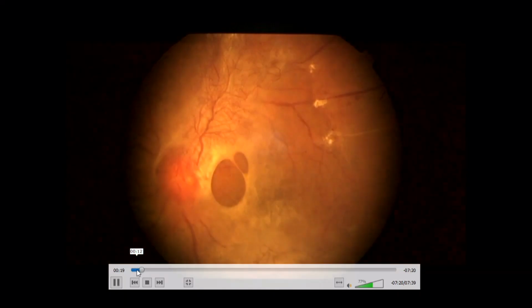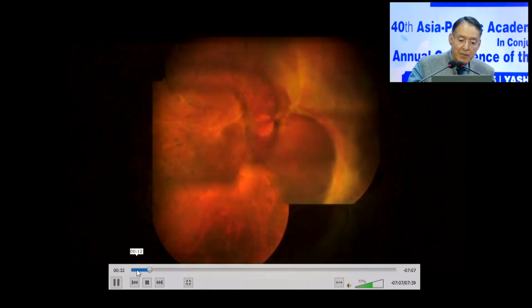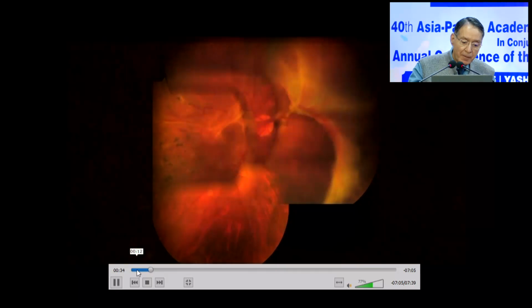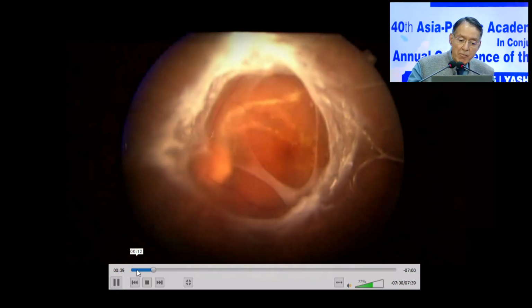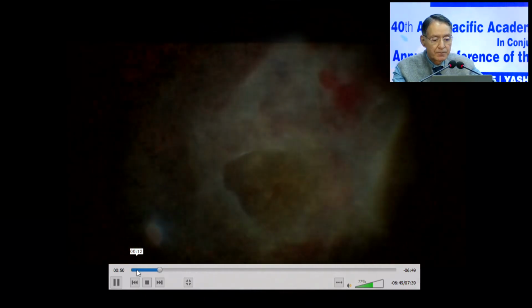Proliferative diabetic retinopathy is an important indication for pars plana vitrectomy. The complex cases can be very challenging. To operate safely and efficiently on these eyes, a thorough knowledge of the pathoanatomy of PDR is essential. This enables the surgeon to make an accurate intraoperative assessment of the changes at the vitreoretinal interface, which can assume several configurations, and achieve complete relief of traction on the retina with the least possible complications.